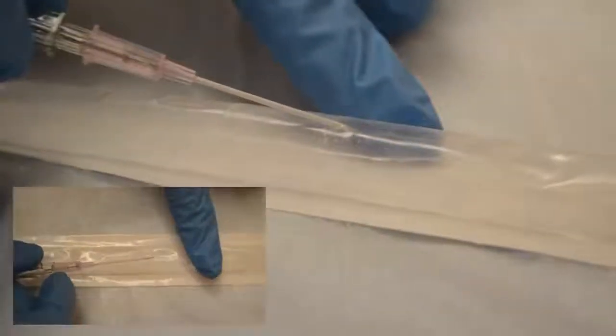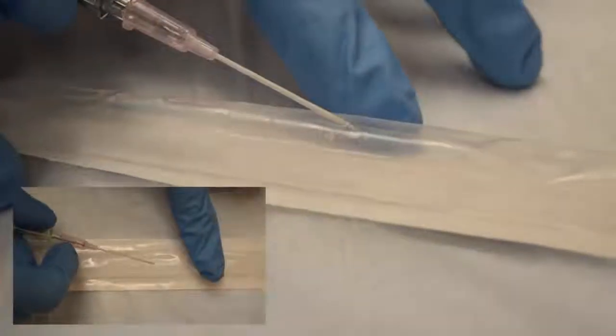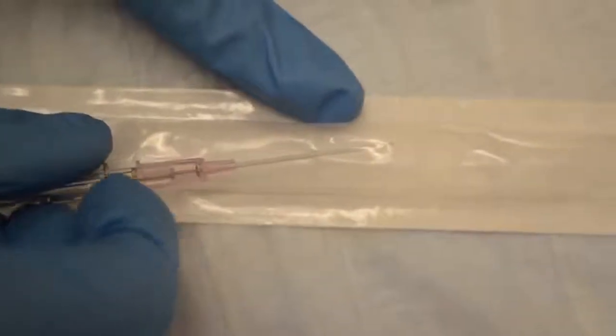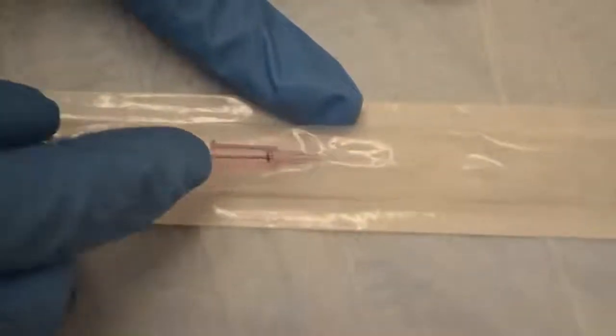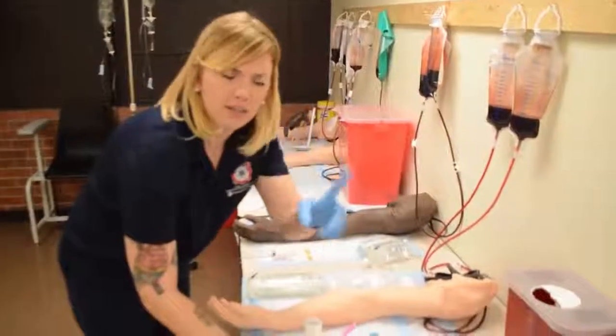If we need to move again, pull back, almost out, and then redirect your hand again and go forward to find the vein. Press forward, oh, we got a flash, then we can go ahead, flatten out, move forward, and then catheterize. Pull out, and this is where we would tamponade. No fishing.